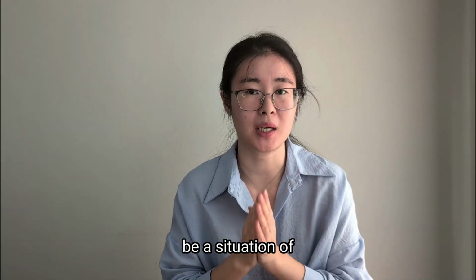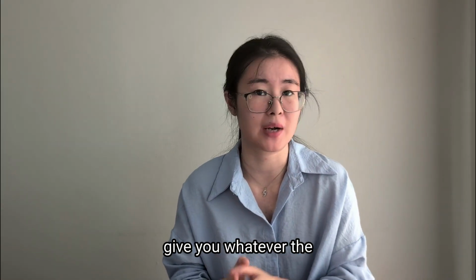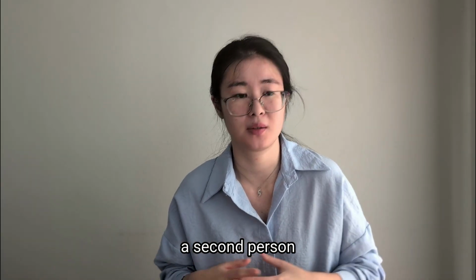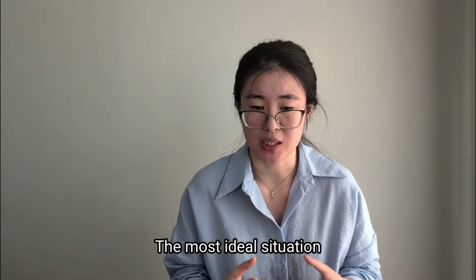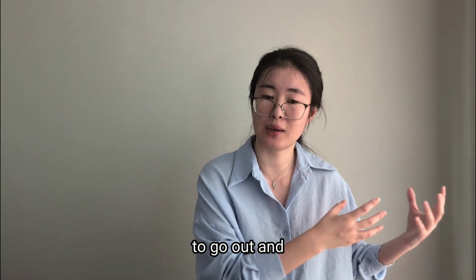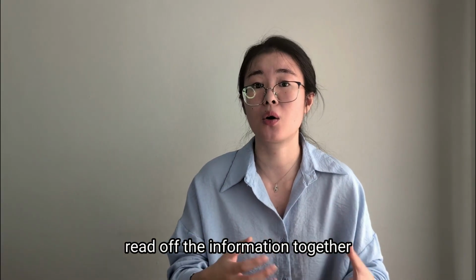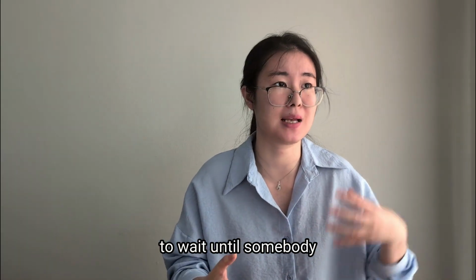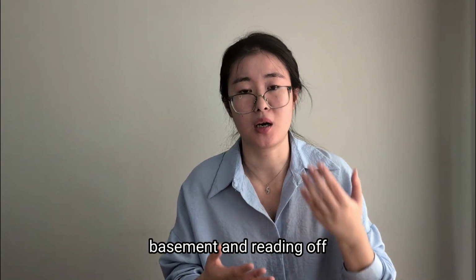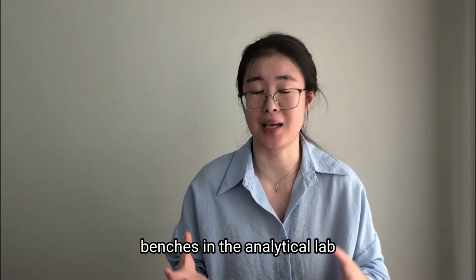So there will never be a situation of just one person working the blood bank and that person just gives you whatever blood products you want. You will always need to have a second person. The most ideal situation is we have 2 people working blood bank, but if not, that person is going to need to go out and grab somebody from another department to come over here and read off the information together. Or that person needs to wait until somebody sends someone from the floor down into our basement and reads off all the tickets together. And that is not happening in any other benches in the analytical lab.